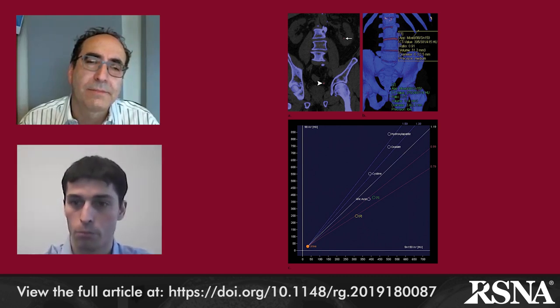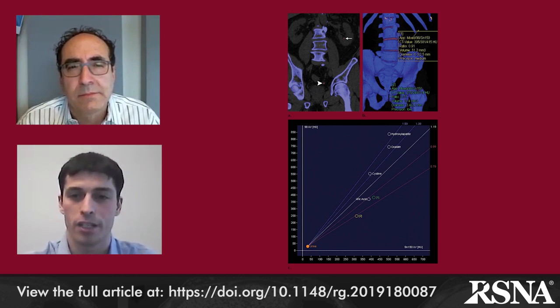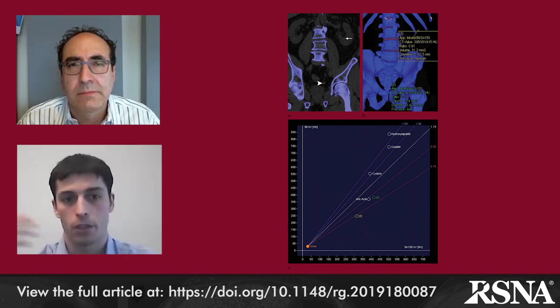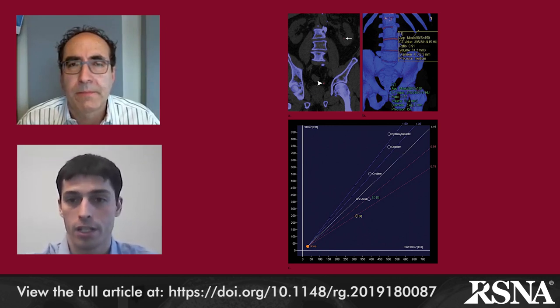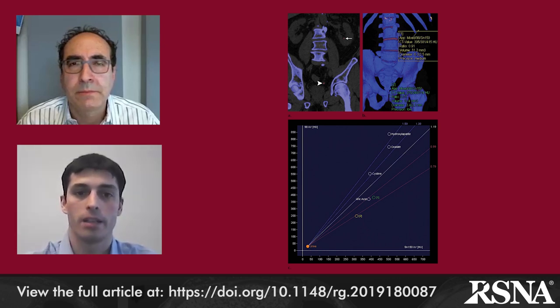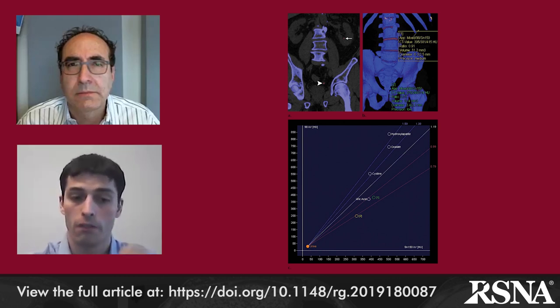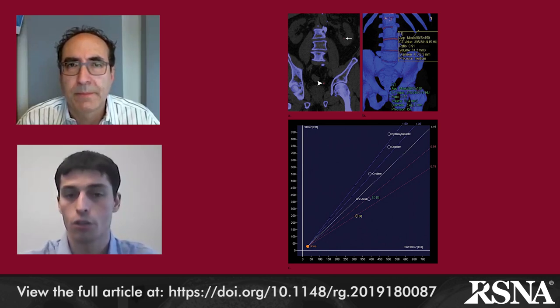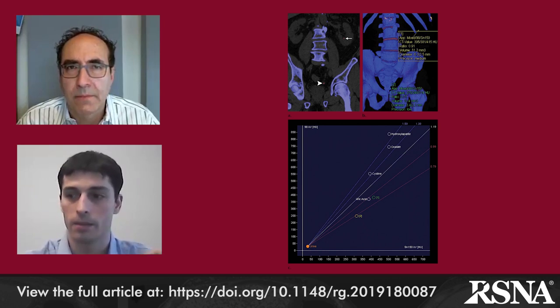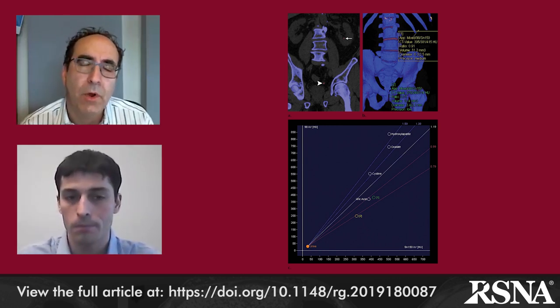Identifying these stones is important to prevent recurrence of obstructive uropathy. Conventional CT has a limited ability to differentiate calcium-based from non-calcium-based stones based on attenuation alone, since their values overlap. However, dual energy CT has been shown to be highly accurate at differentiating those stones, with diagnostic accuracy ranging from 90% to 100%. This is mainly done using the dual energy index — the ratio of attenuation from low KV imaging divided by high KV imaging. Uric acid stones have a ratio of less than one, meaning their attenuation is lower at low KV than at high KV, which is the opposite for calcium-based stones.